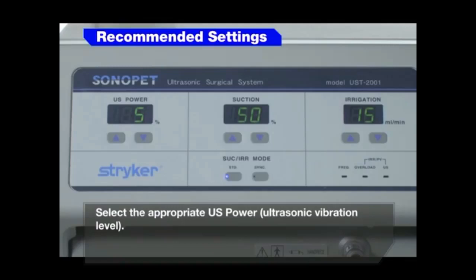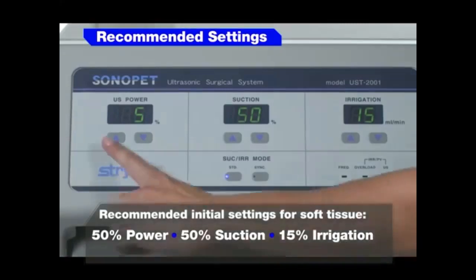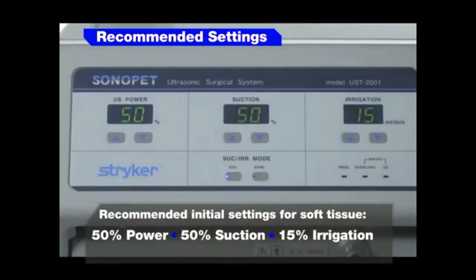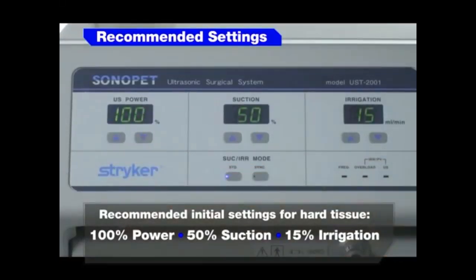Select the appropriate US power and level. Recommended initial settings for soft tissue: 50% power, 50% suction, 15% irrigation. Recommended initial settings for hard tissue: 100% power, 50% suction, and 15% irrigation.